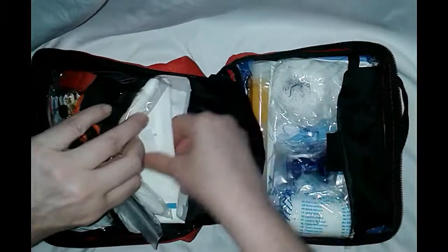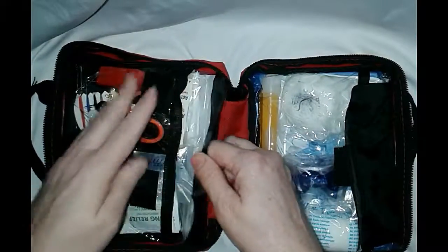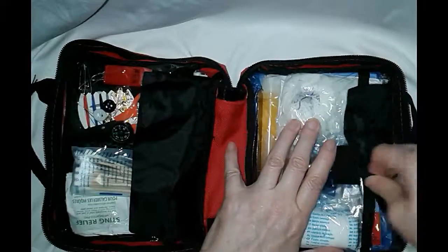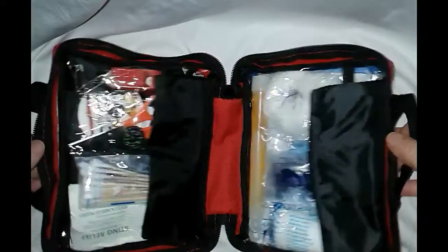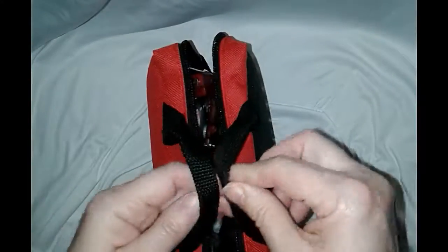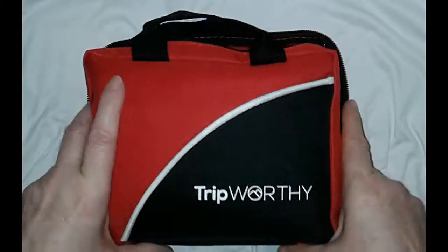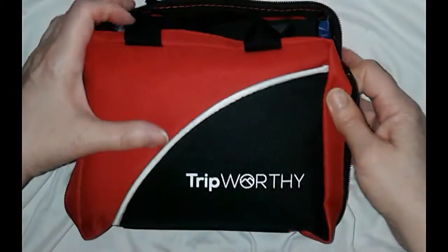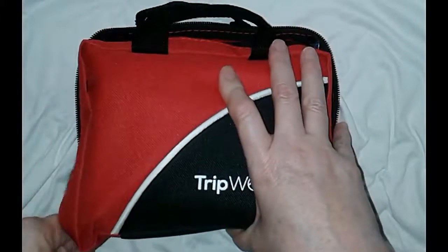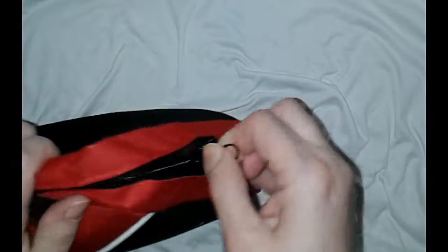There are two triangle bandages and sterile gauzes in different sizes. This is really nice — absolutely perfect for somebody who's backpacking, or if you're in a car accident out on back roads. You could easily put this in your backpack, clip it to the side, or take it to your kids' sporting events where somebody always seems to get injured or stung. I genuinely like the size and the compactness — there's no wasted space in here.